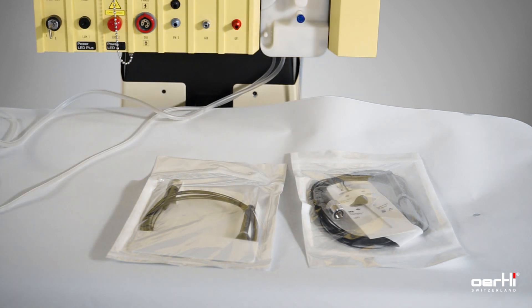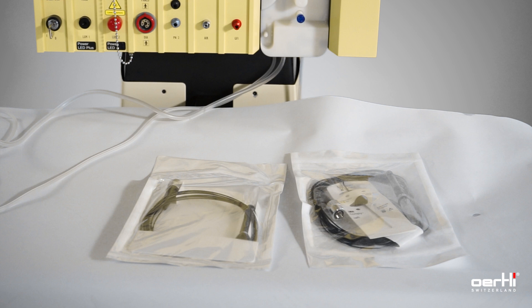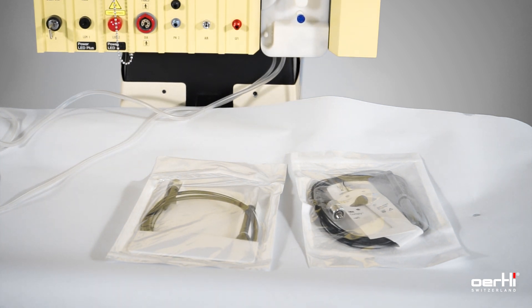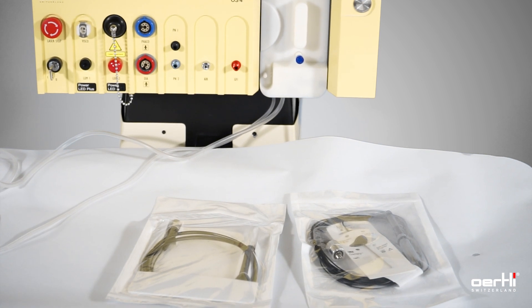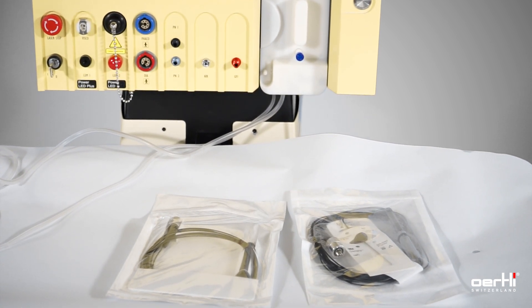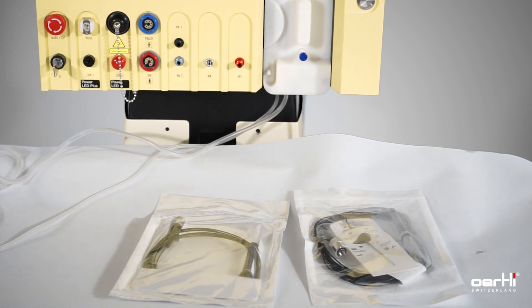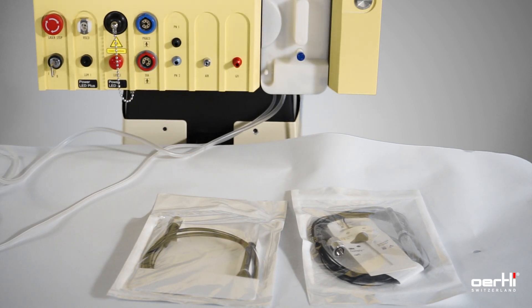How to install the laser hand probe and the illuminated laser hand probe. For visual purposes, we have removed everything else from the table, like the cutter, light instruments, and so on. We also removed the sterile bag from the display and the outer bags from the laser sterile bags.